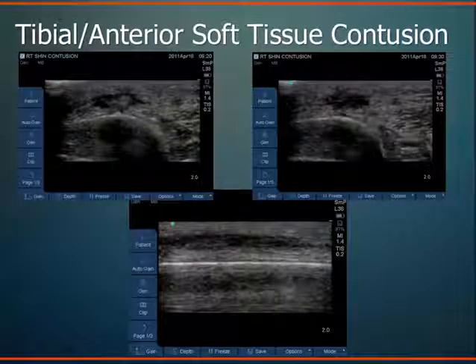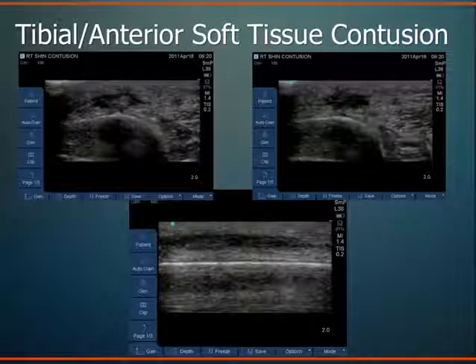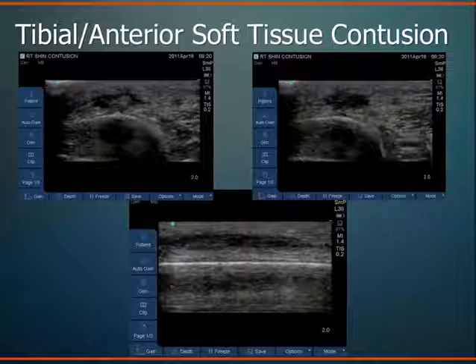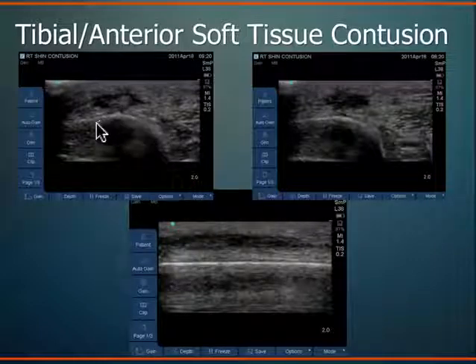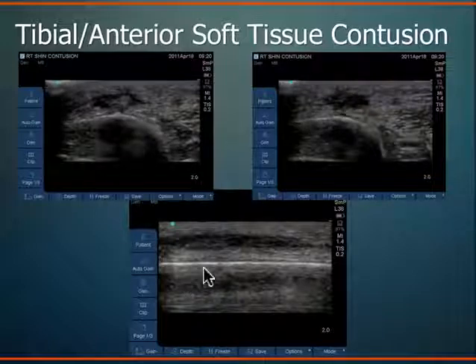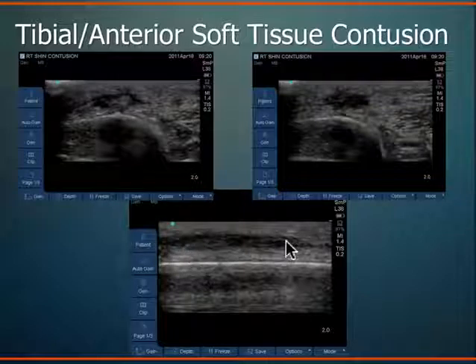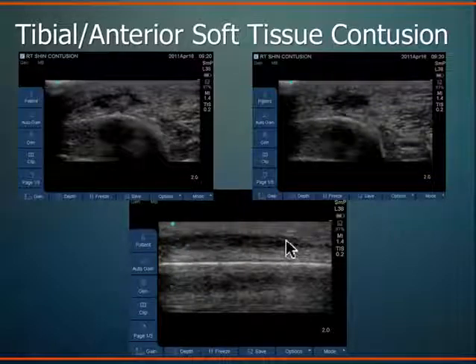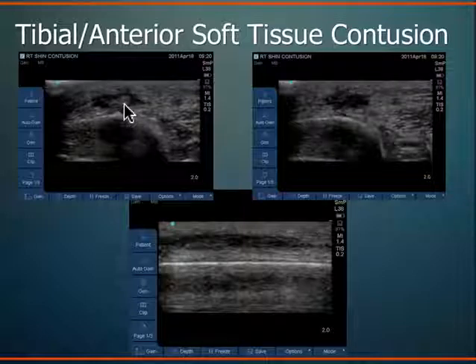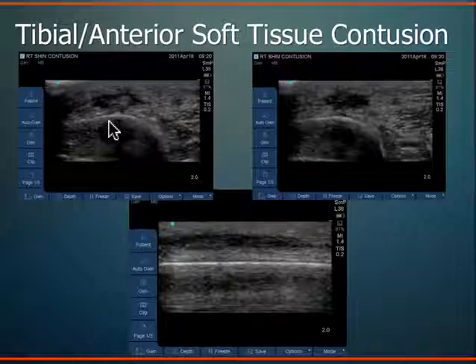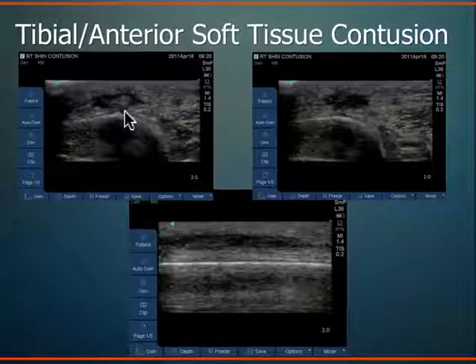This was a baseball player a couple of weeks ago who got hit in the shin — classic tibial contusion. Not necessarily something you would typically image clinically, but a great example of what you can see on ultrasound. Short-axis view of the tibia, long-axis view, and you can see the superficial subcutaneous collection of fluid from the hematoma and tissue disruption. You can actually see tissue debris — sometimes with hematomas you get thickening of the tissue and collection of tissue debris, which can cause other complications you could follow on ultrasound that you might not see on x-ray or other imaging modalities.